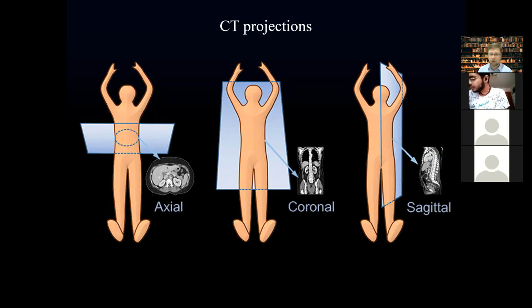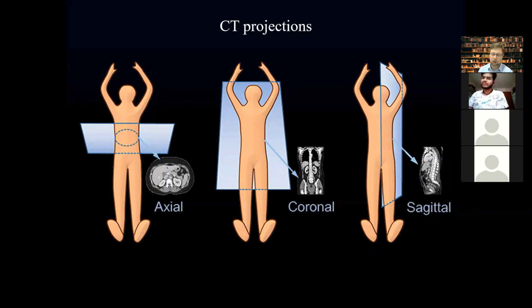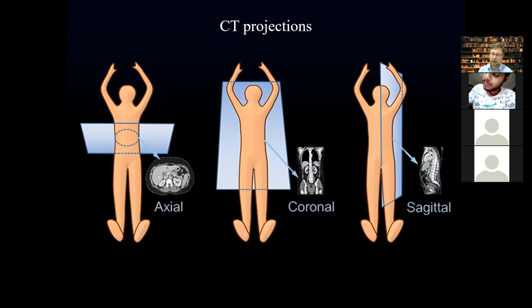So you must remember always to decrease the radiation dose in your patients, and always ask your patients, have you already undergone an X-ray examination or nuclear examination this year, and what was the dose? The dose always must be recorded on paper, on the report, and you must calculate this dose.